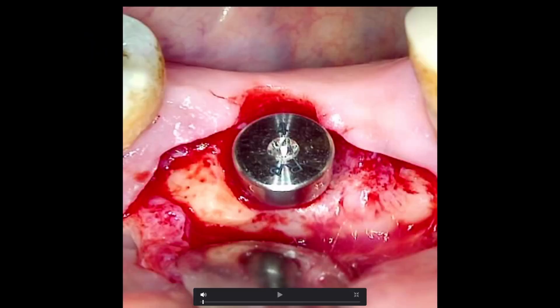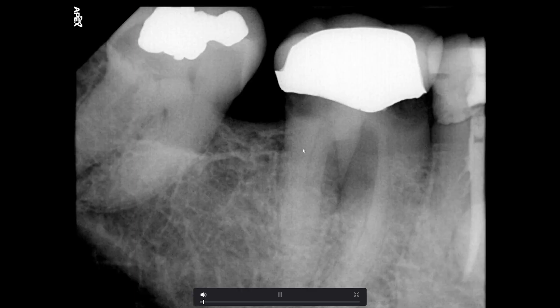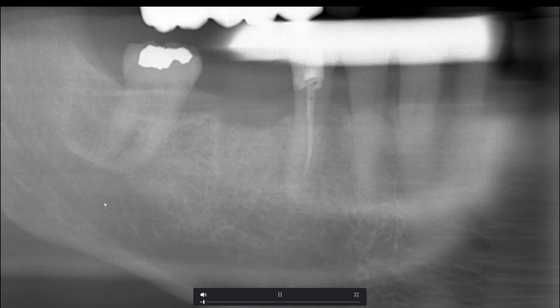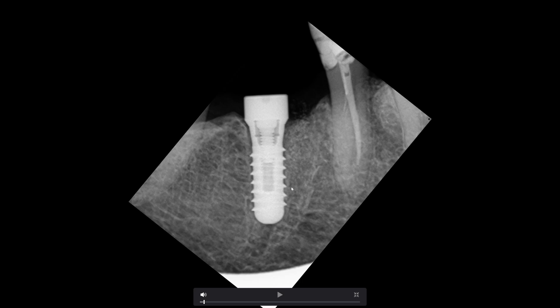Here's where we ended up at the end of the surgery, and there's a PA. Here's the case: three months prior, the patient presented for an exam with pain in the lower right, painful to bite on, huge decay under the crown, and we decided that the tooth was not savable. We made a plan to extract and then place an implant three months after the extraction. We took a panoramic and we can see that the inferior alveolar nerve is way down below in the jaw, so there's plenty of bone to work with, lots of width as well — simple freehand surgery. There's the post-op PA.